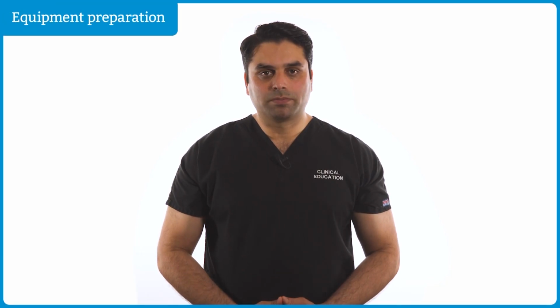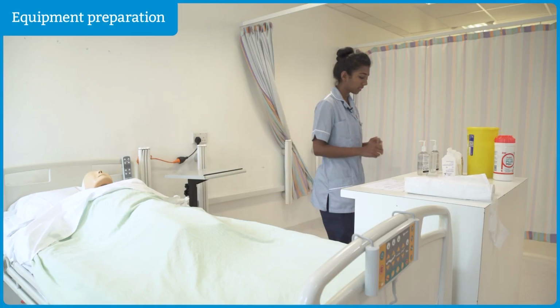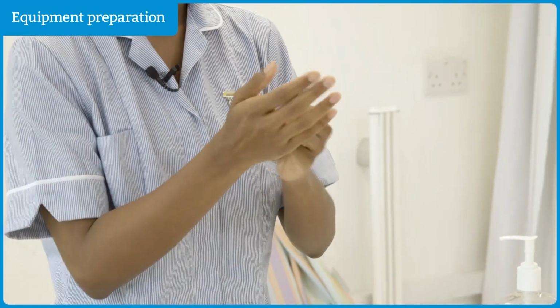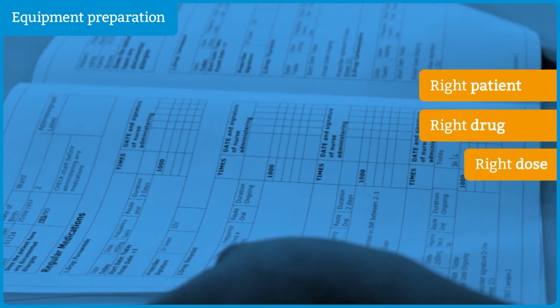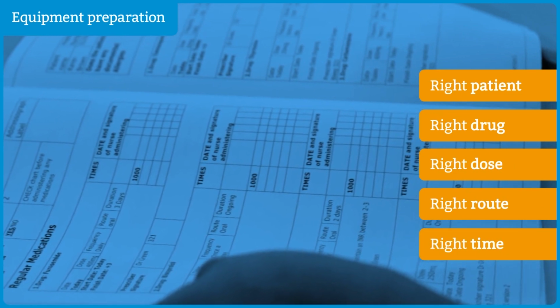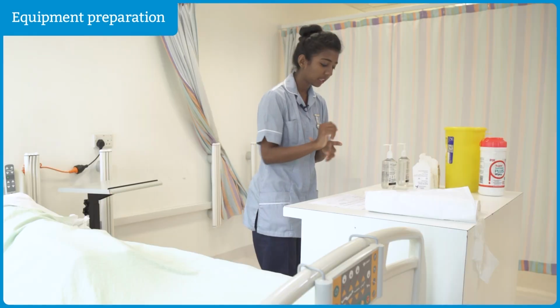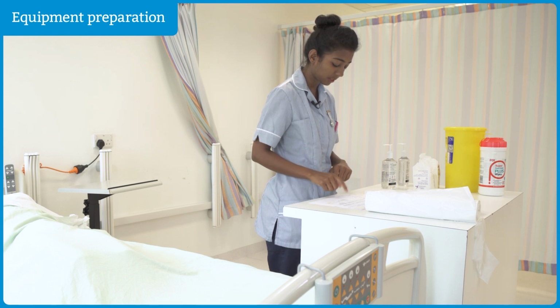Before preparing the equipment, clean your hands. All right, so I'll be gathering all the equipment needed for the injection. So I'll do the hand rub first since I've touched the patient. Check the prescription details against the medication. Remember to check the 5 R's. Record the batch number on the prescription chart. After doing the hand rub, I'll do a full prescription check of all the details of the prescription.